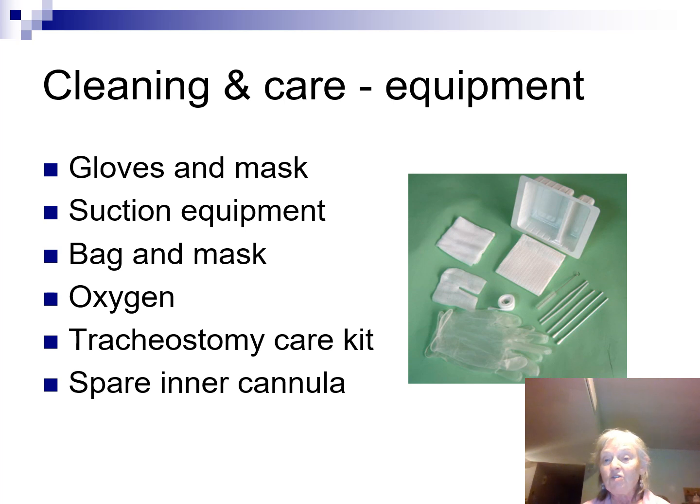Your best bet is to try to hit the call bell, maybe have somebody go get you a box of cannulas or spare cannulas, or see if there's any on the floors. Always check it out before you ever start the procedure.